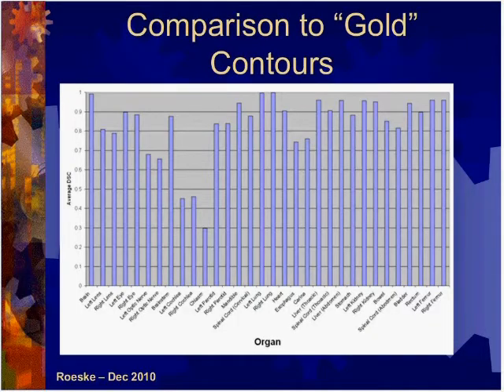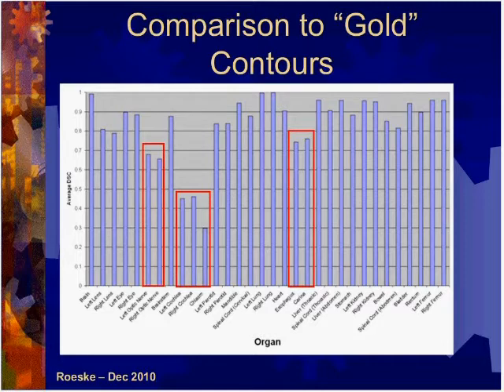We now look at all the organs that we talked about previously. Starting on the left here are the organs in the head, so the brain, pretty much the list that I showed you a few minutes ago. Here are the organs of the neck, thoracic organs, abdomen, and then finally over here, pelvis. And I plotted here the average Dice score, taking all the dosimetrists, averaging their scores together as a function of the organ.